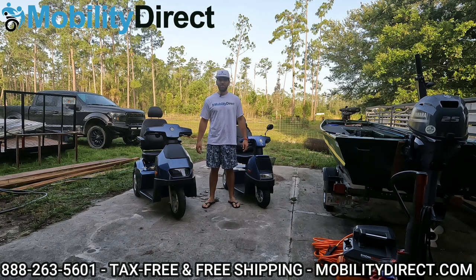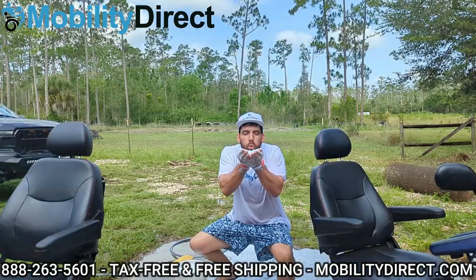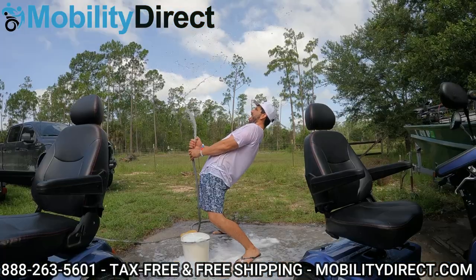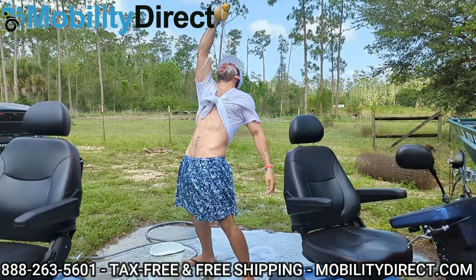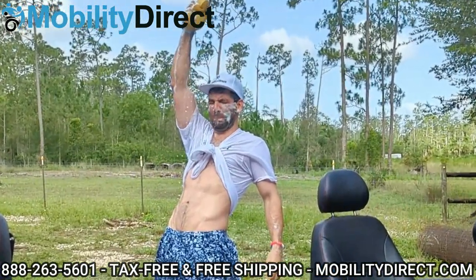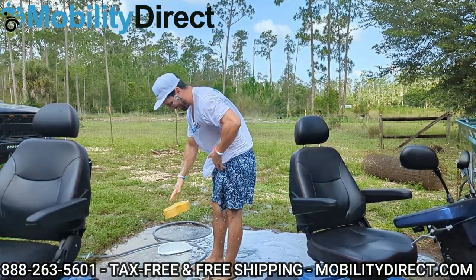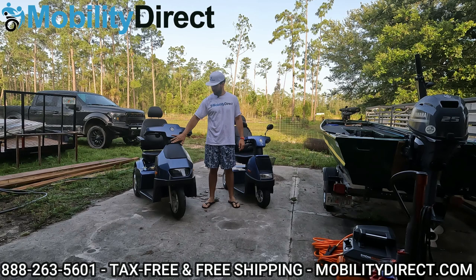Hi everybody, I'm Sergio with Mobility Direct, and today we're going to show you how to wash an Afikim Afa Scooter. I have the S model three-wheel configuration here, and the C model three-wheel configuration.